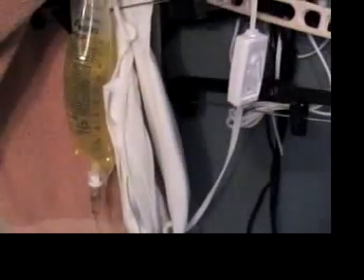Also, you can kind of see here, I keep a heating pad here. In the wintertime when it's cooler, I actually turn this heating pad on a half hour to an hour before I give fluids, so the fluids are warm and not cold if it's been cold in the house.